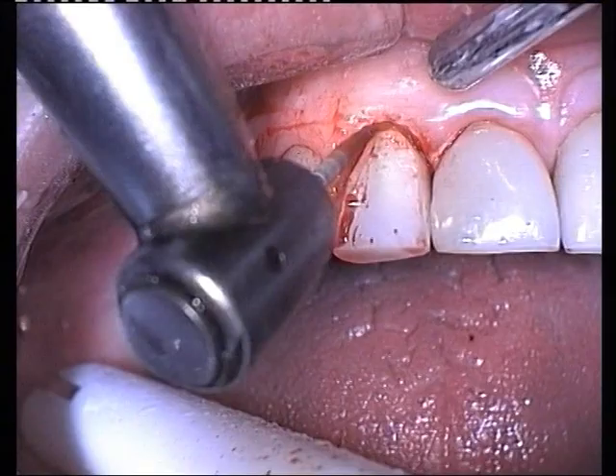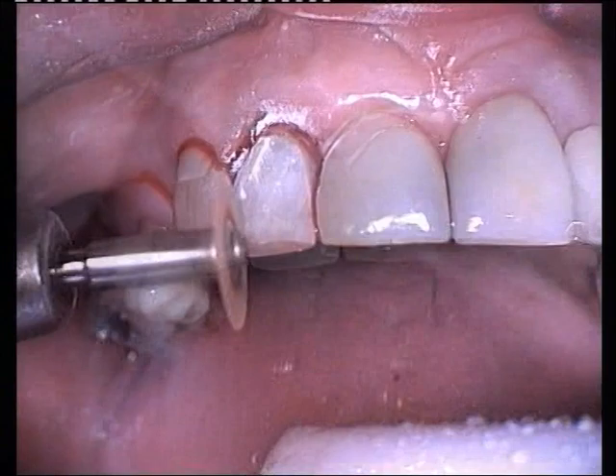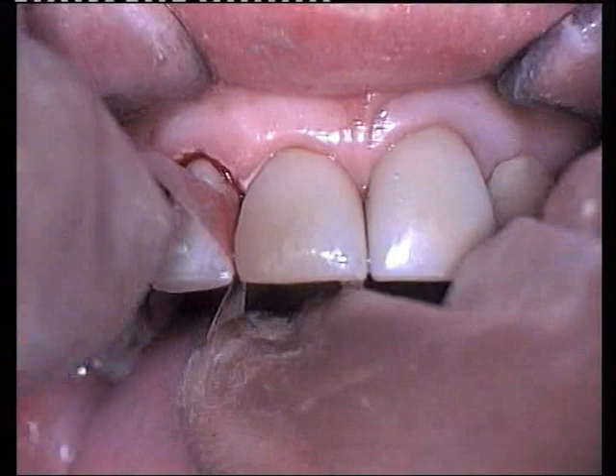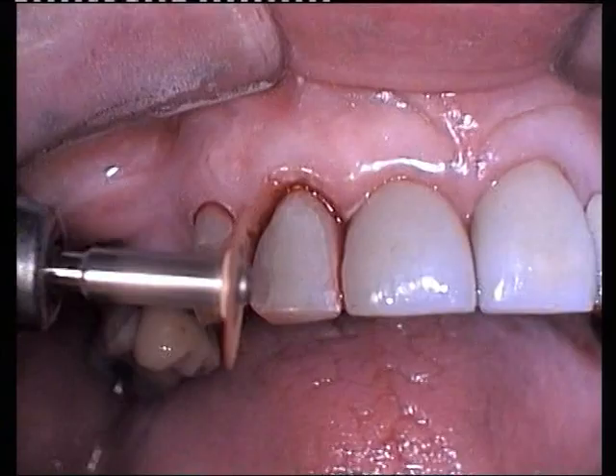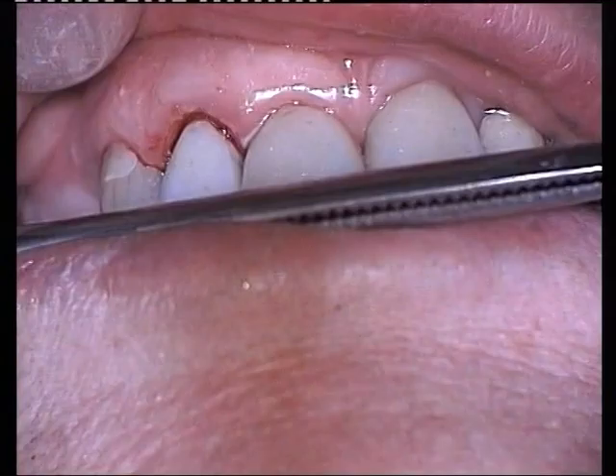Further contouring is carried out with a coarse interproximal soft flex disc. Interproximal finishing is done with aluminium oxide flexible strips. Incisal contouring is carried out with a coarse soft flex disc. The occlusion is checked with articulating paper in centric, protrusive and lateral movements.